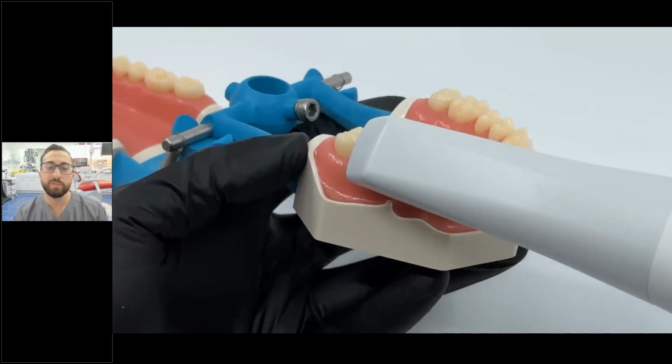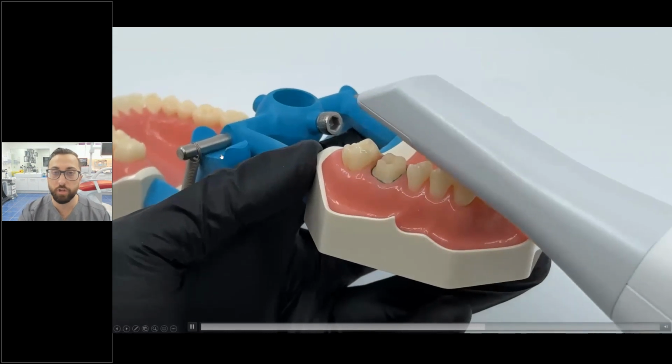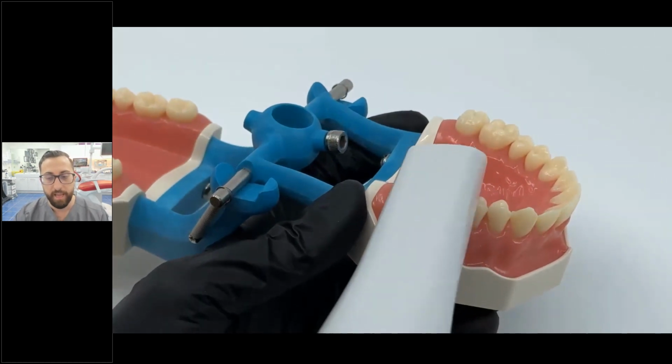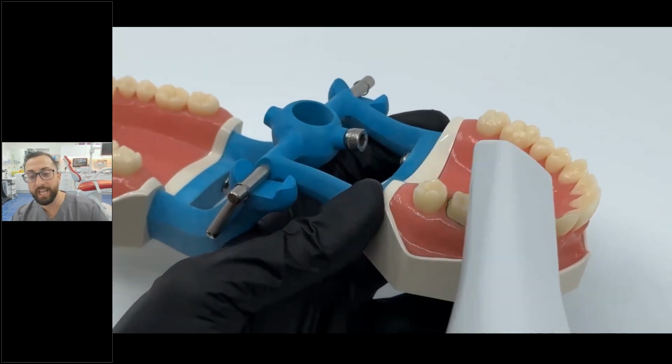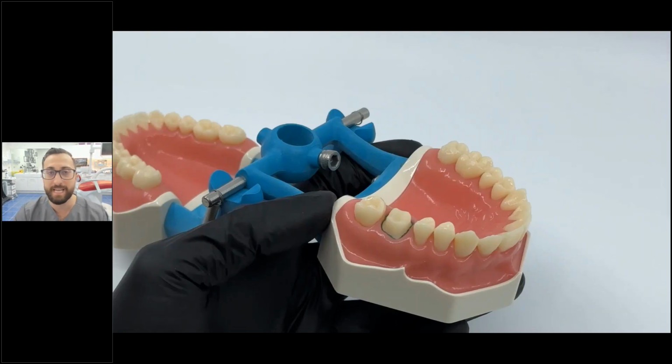And oftentimes when I'm taking these scans, it is only then I would go back and fill the areas of the contacts, as you can see here. And going perpendicularly, as you can see, is a great way to fill those contact areas. And it really is that simple, guys.